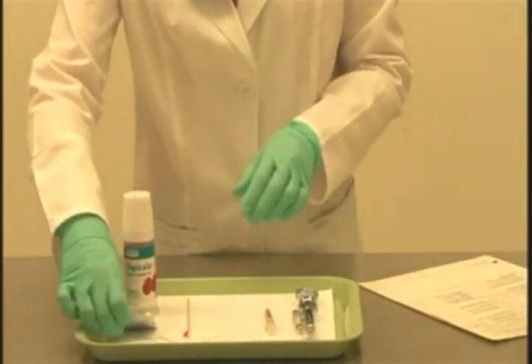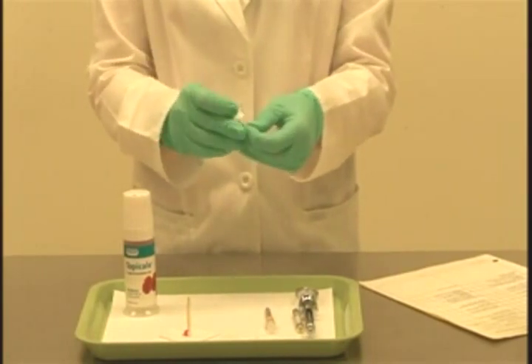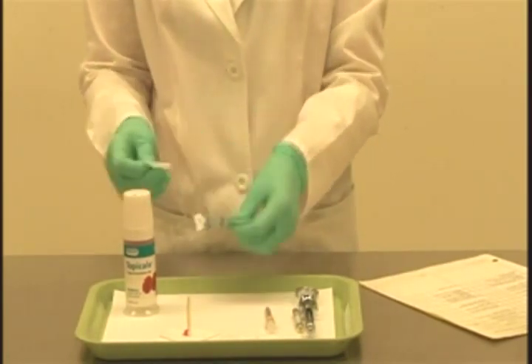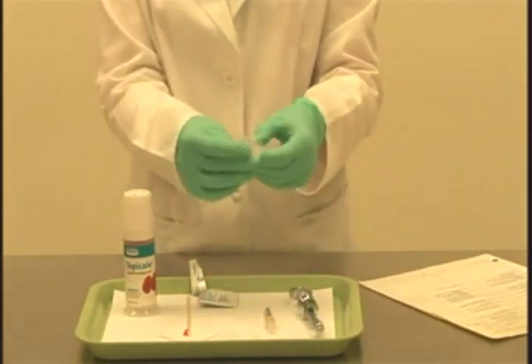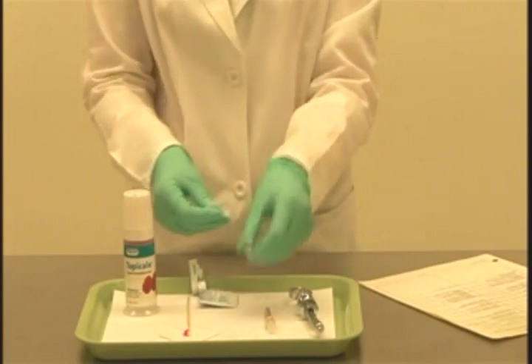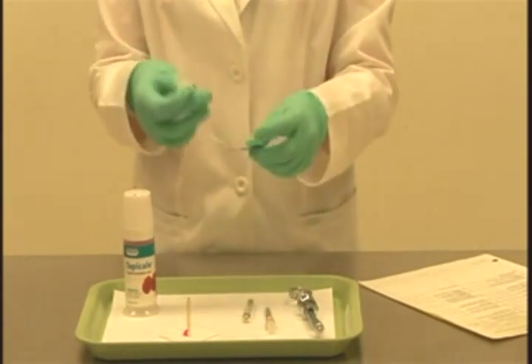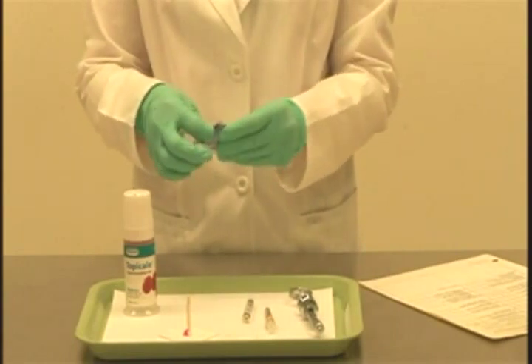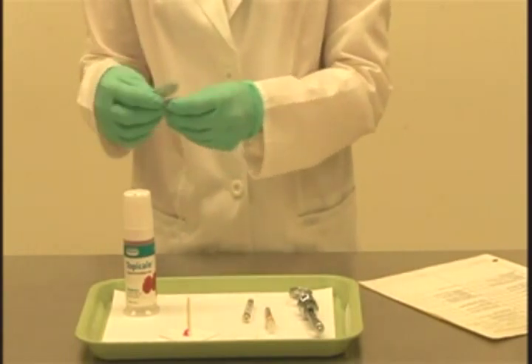I'm going to take my alcohol wipe now and just wipe down both ends of the carpule — the rubber diaphragm end and the rubber stopper end. Then place the alcohol wipe back into the package when finished, just to keep the tray organized.